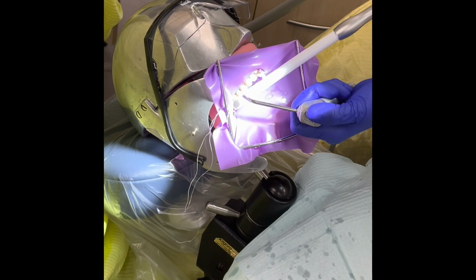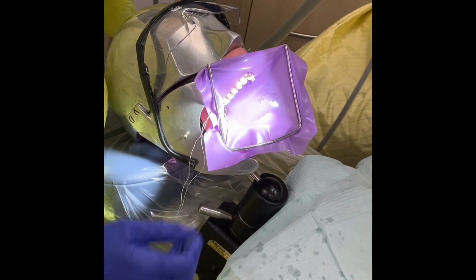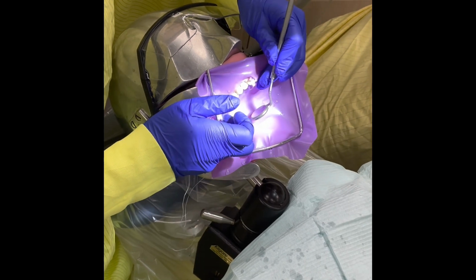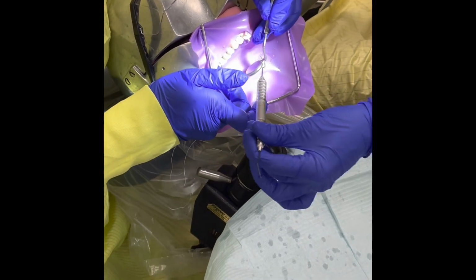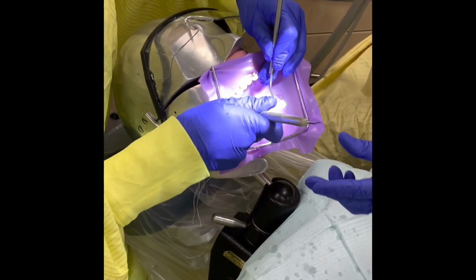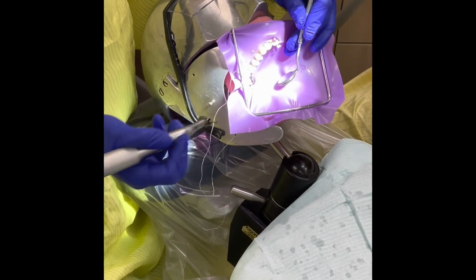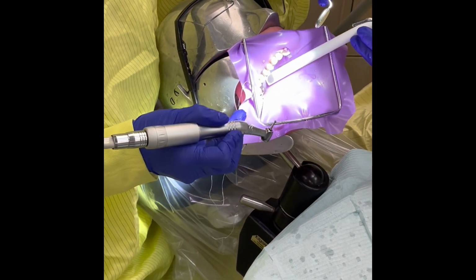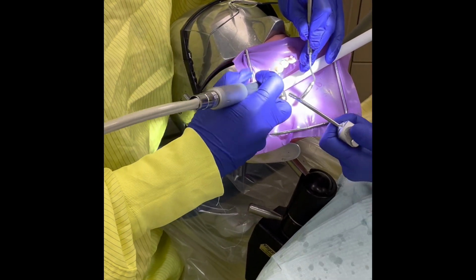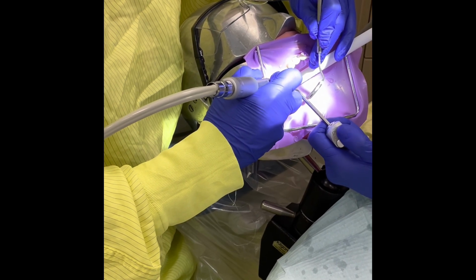Okay. Rinse and dry. I will take my explorer, please. Thank you. Okay. I'm going to move on to my low speed again here, Stacy, please. Thank you. Again, blowing into the preparation.